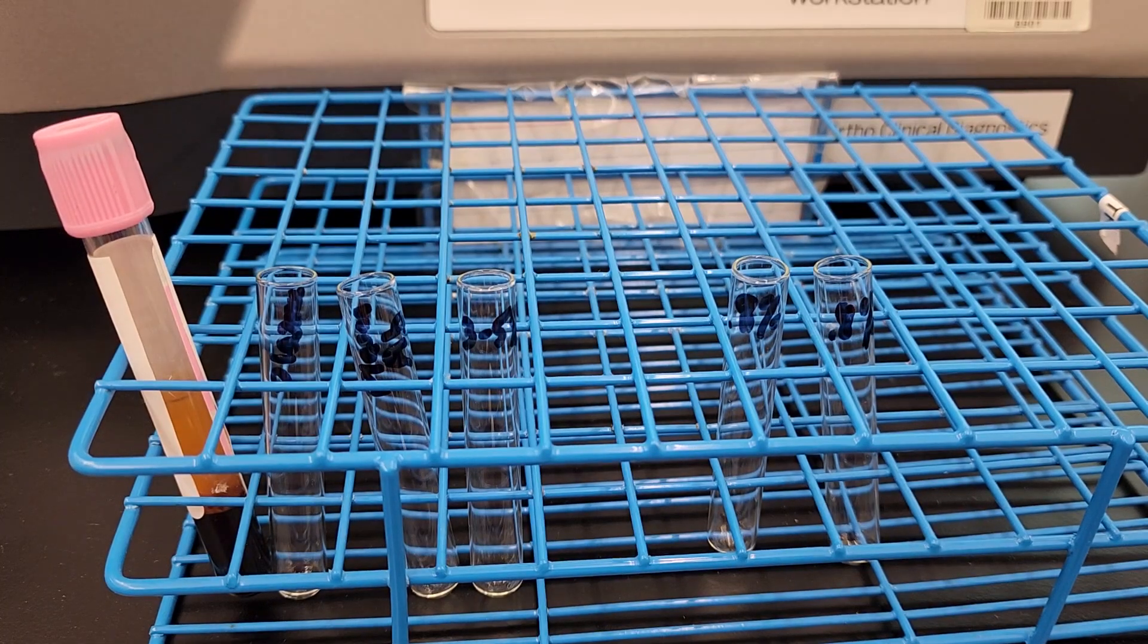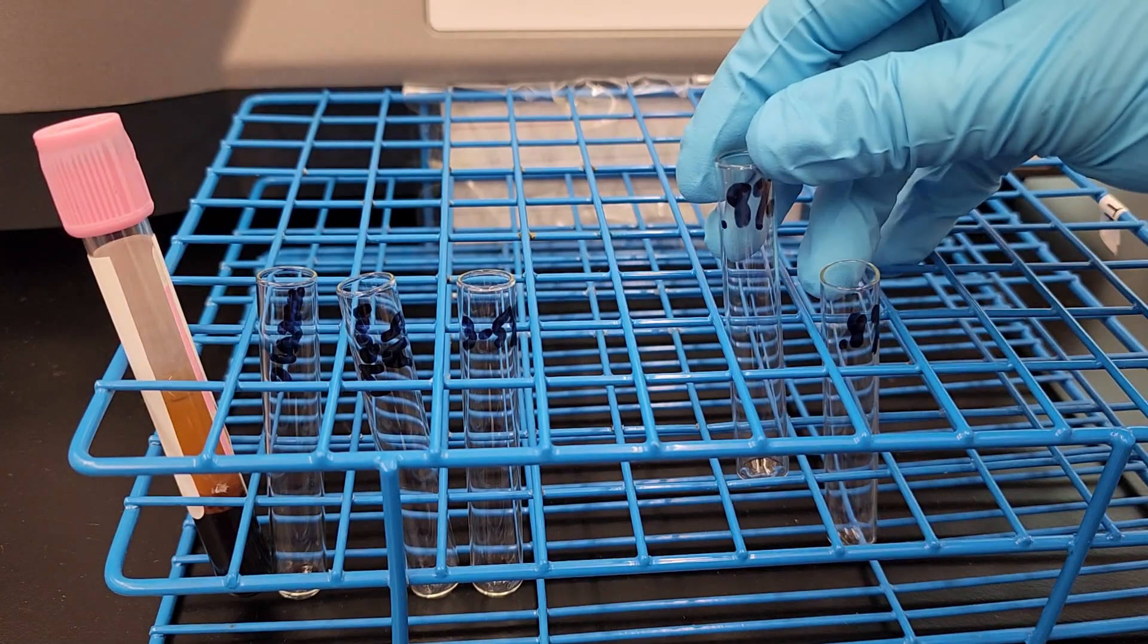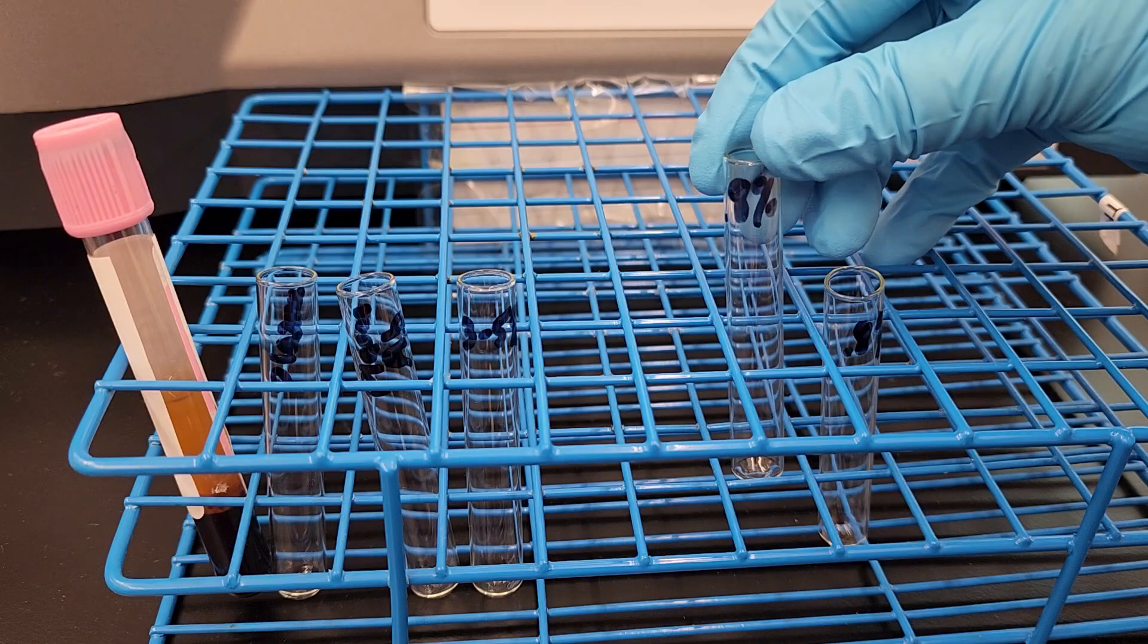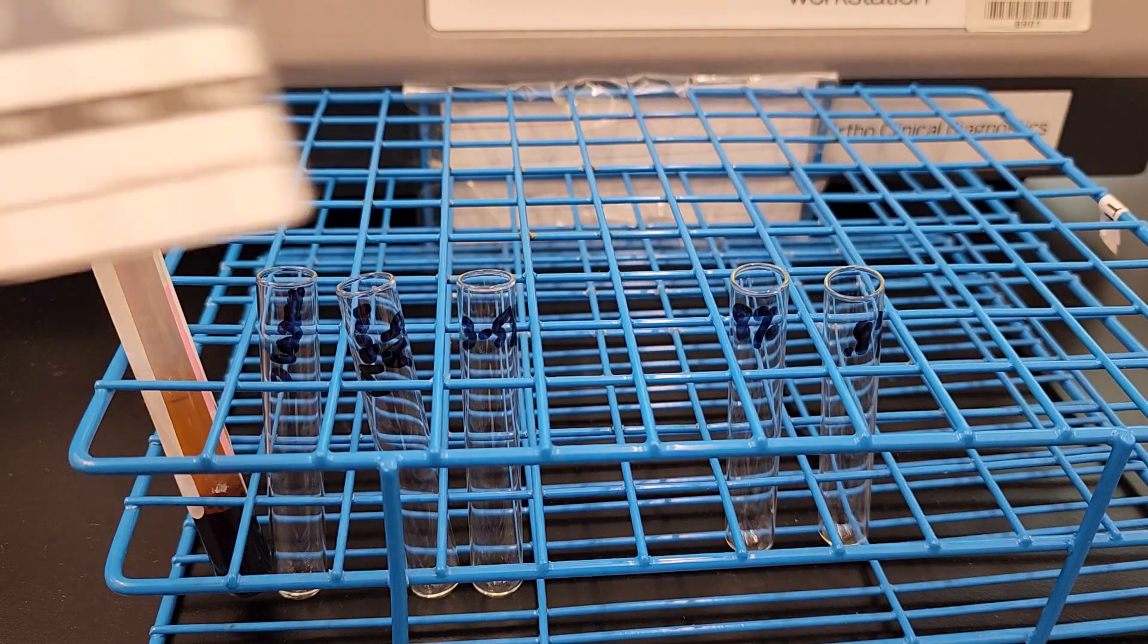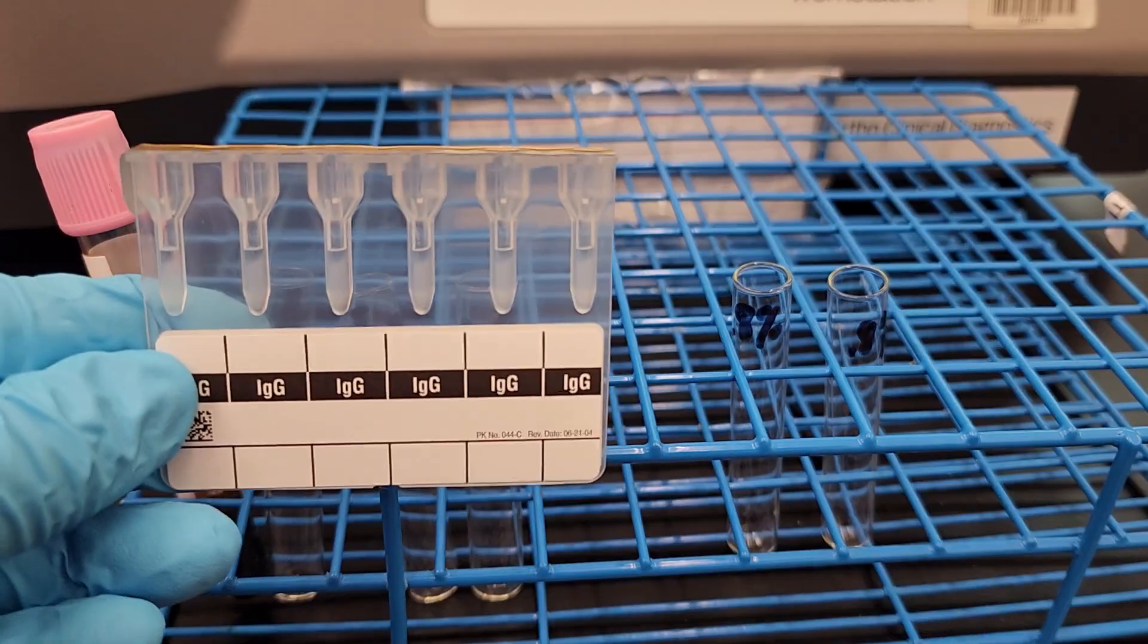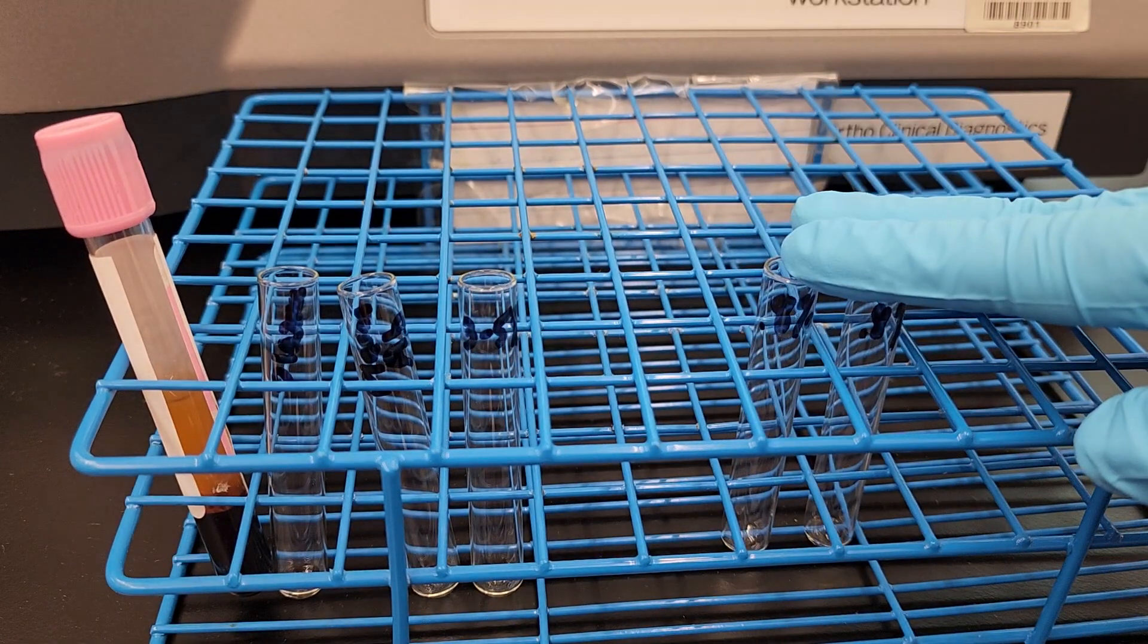Hello everyone, today we are going to learn how to make a 0.8% red cell suspension for use of gel blood banking technology in two different ways.